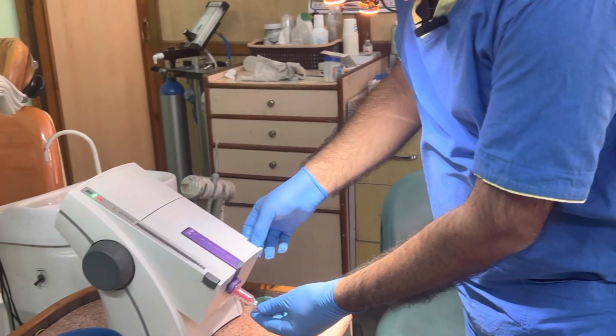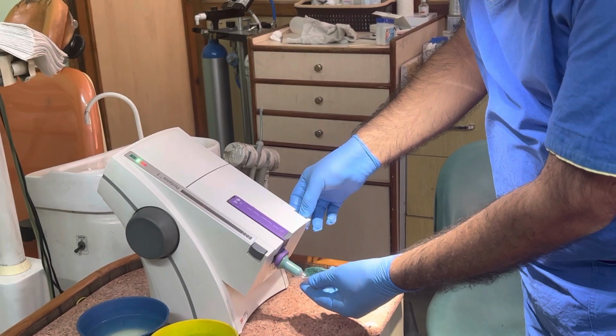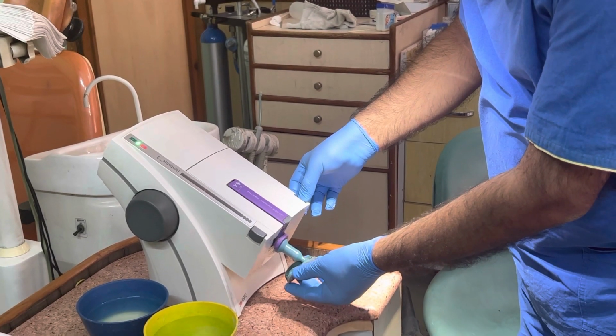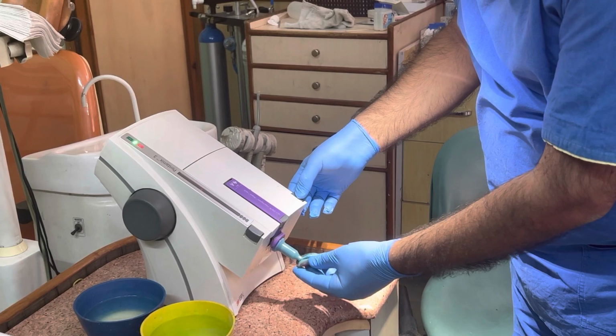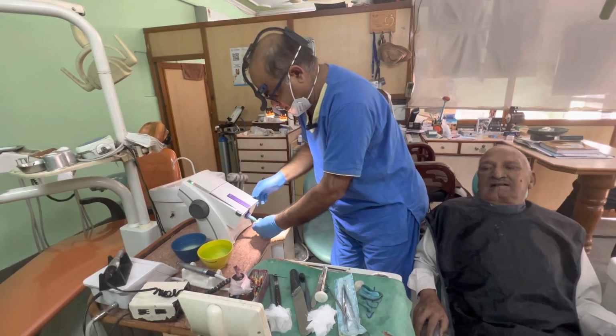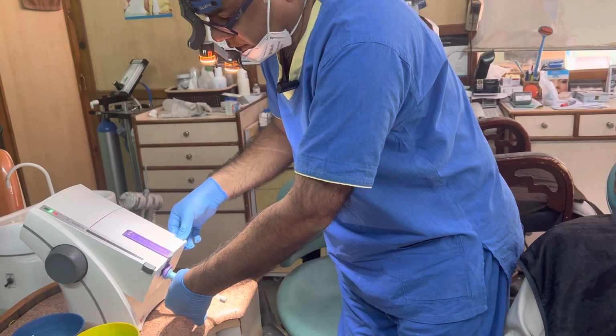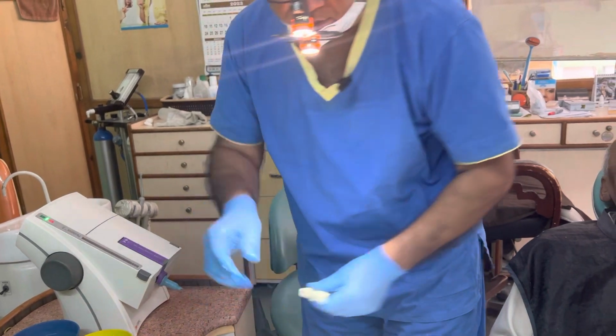So I am using this polyether impression material from Pentamix. So we have to fill it. Don't overfill it.